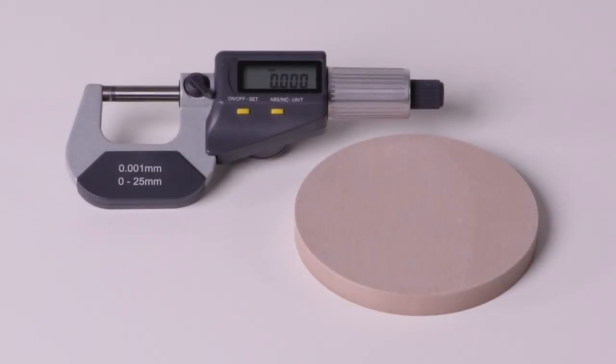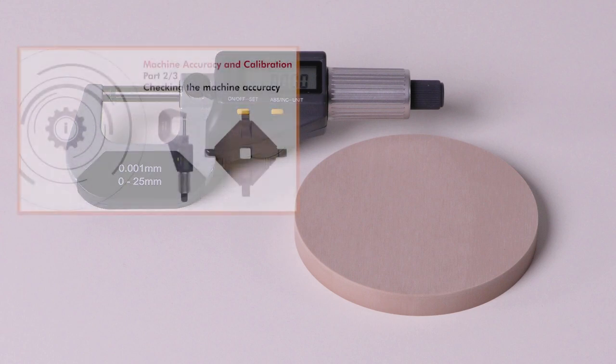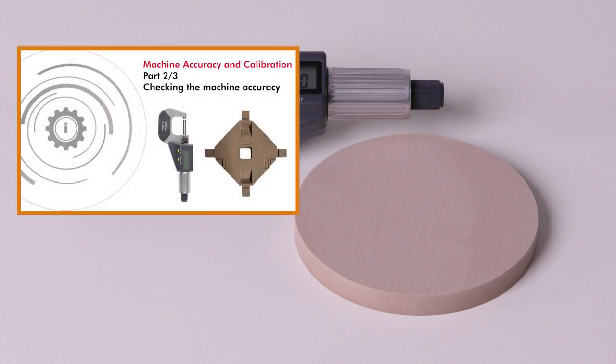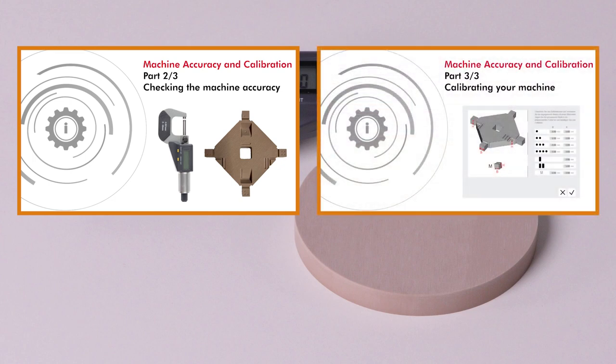As you have seen in this video, it is really important to learn how to use the micrometer correctly before measuring calibration or test specimens. If your measured values are imprecise, your calibration will fail. Incorrect usage of micrometers is a common reason for machine downtime. We provide two separate videos to show you how to check the accuracy of your machine and how to recalibrate your machine if necessary.